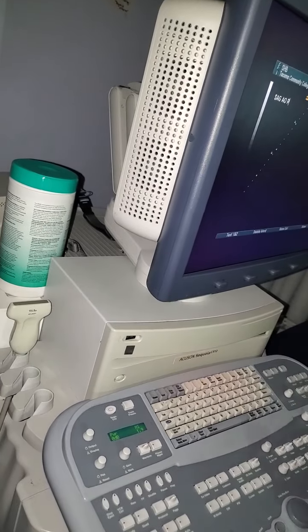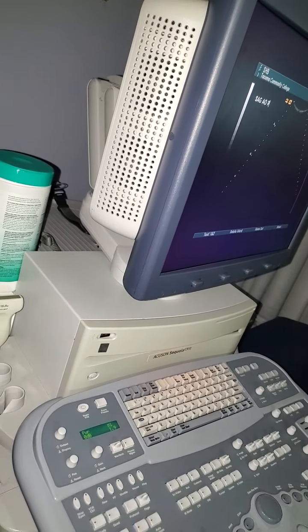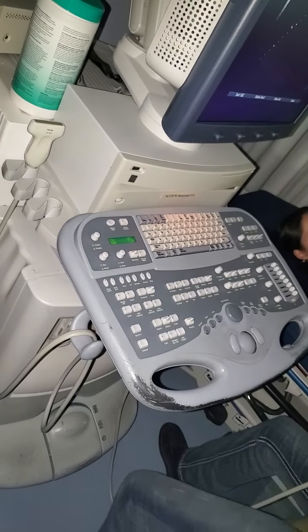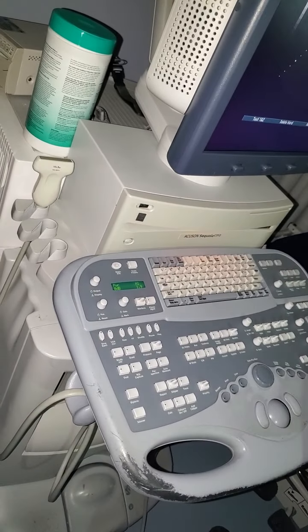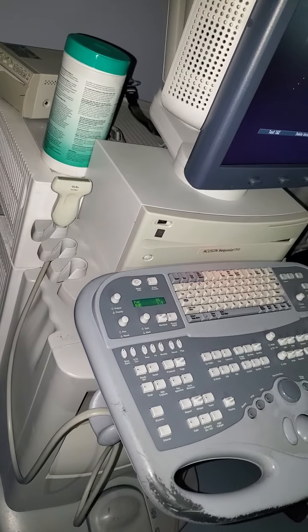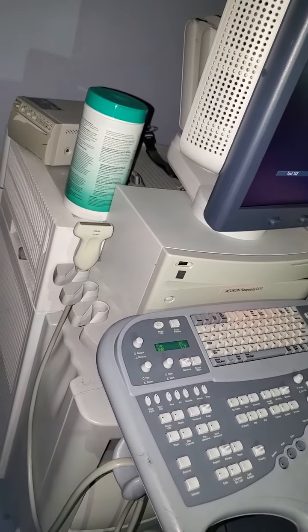Start out with this. And typically I put my unused probes over here and my used probes over here, like the ones I'm working with, and then my ones that are just kind of hanging out. You can put the gel on your patient if you like. More gel is not going to get you better results, I'm going to tell you that right now. But anyway, I usually do it just on the probe, so again, not touching that tip of the gel to my patient. What you don't want to do is, like doing a thyroid, do the ketchup bottle thing, and then it farts all over their face. You probably don't want that.